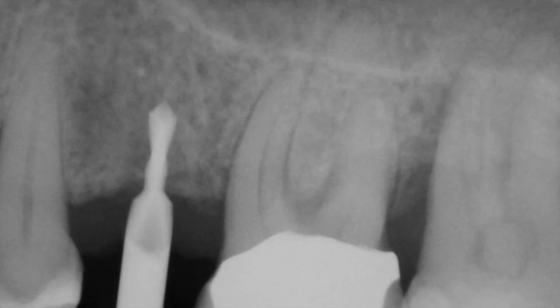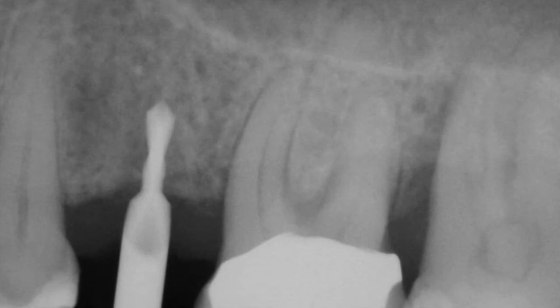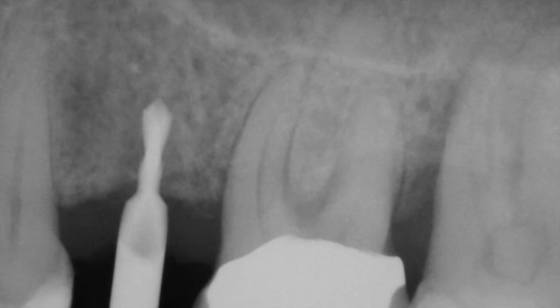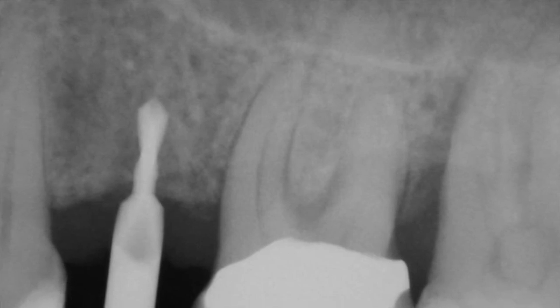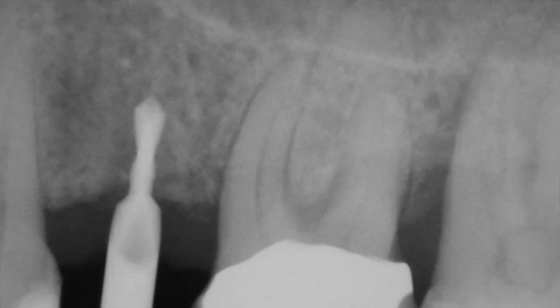It looks like we could have good emergence profile. You've heard me say that implants today are prosthetically driven, and so all my surgical applications are intended to improve or work upon the final smile design and emergence profile of that implant placed into the jawbone. I've just gone a little bit into bone, and I'm happy with my angulation.